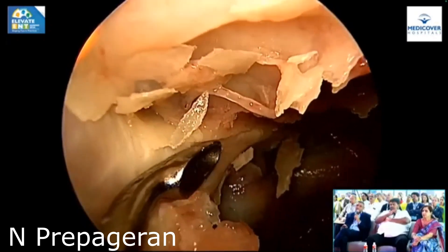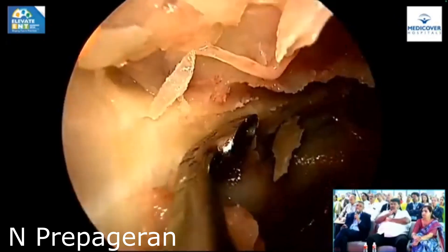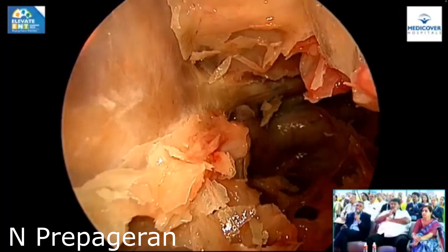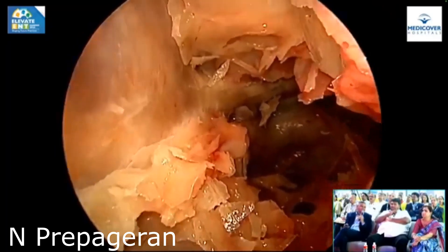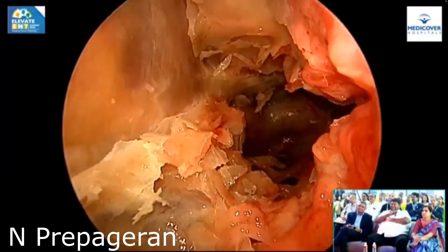This is the optic nerve, no? Do you open the nerve sheet or you don't open it? Wait — patience, my child. Let me take out all the bones first.